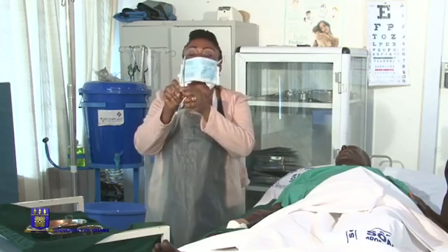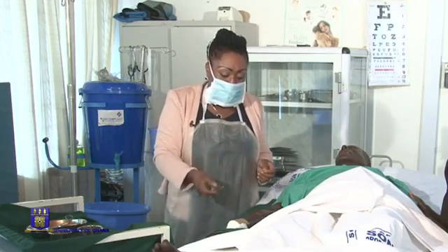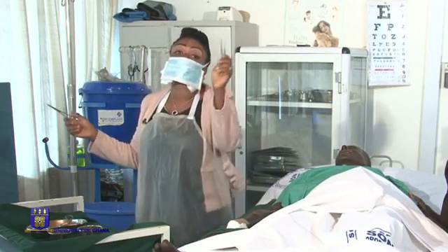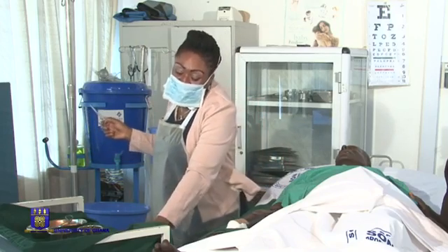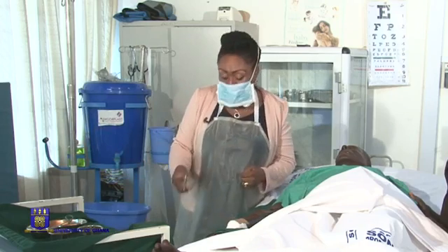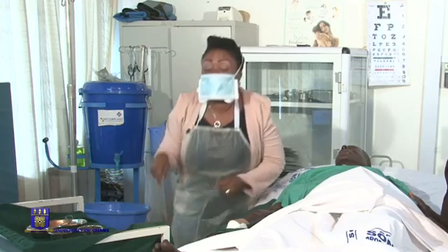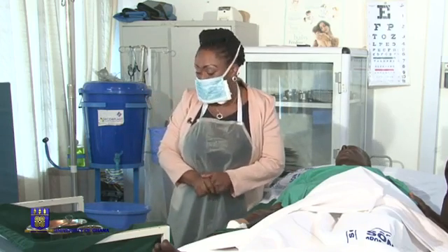This forceps is now considered contaminated because it was used in cleaning the wound. But the dissecting forceps is still clean because it hasn't touched the wound, and therefore we are going to use it in applying the dressing to the wound. So again, we put it in the receptacle for used instruments.